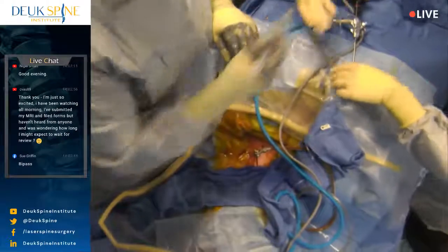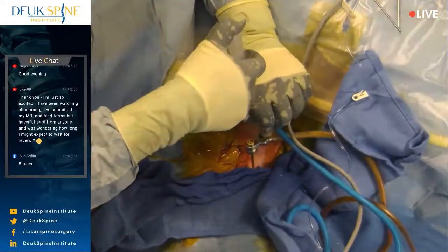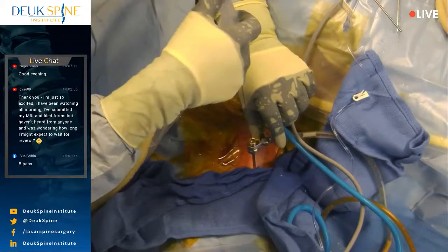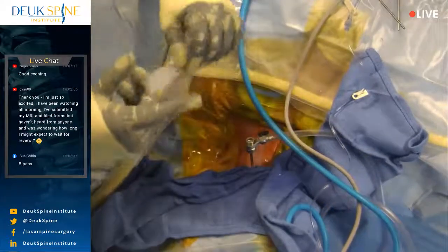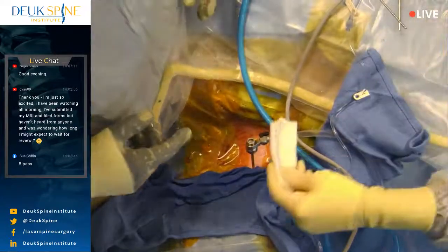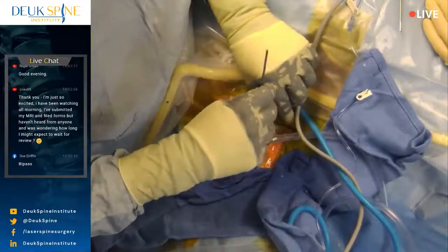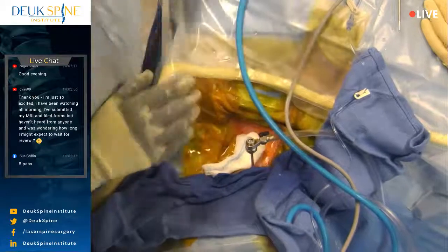Okay, these people all go home. They go home the same day. They all go home today. We've never had to admit a single one of these patients. It's very minimally invasive, as you can see. And this patient will be ready to go in about an hour.